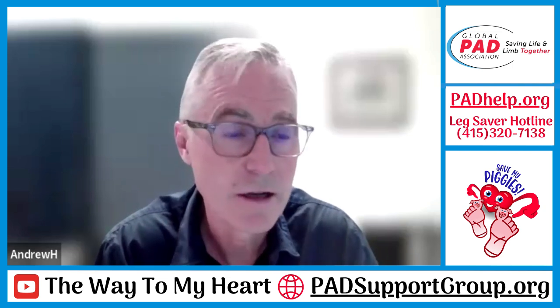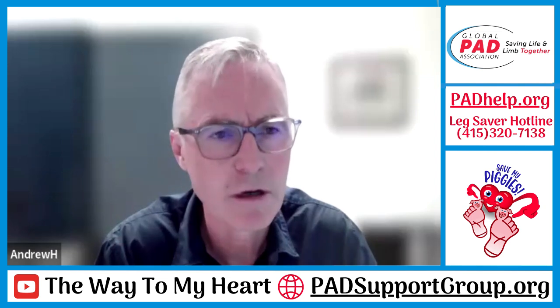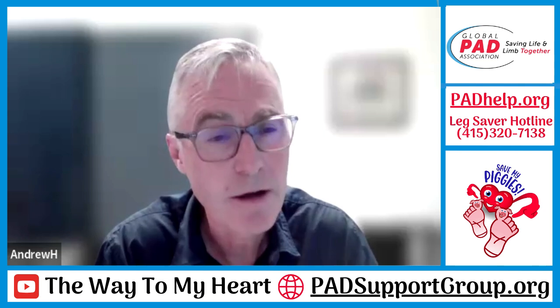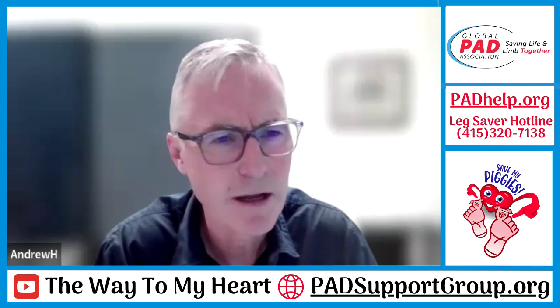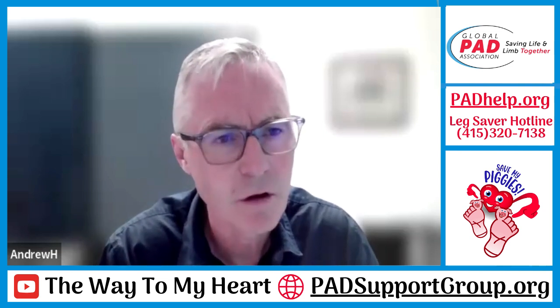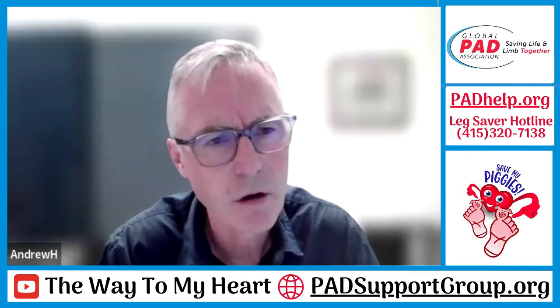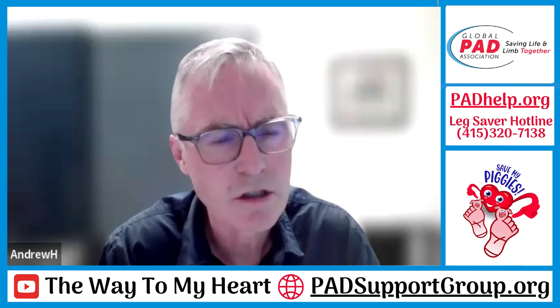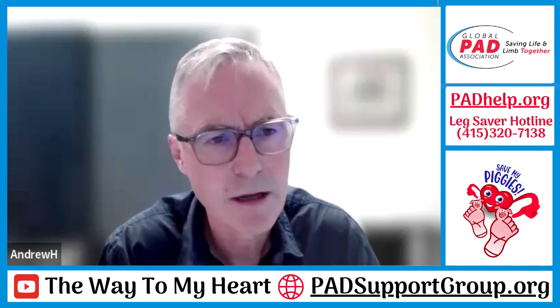And of course, this is a non-traumatic technology, and we saw a really good safety profile with our first human experience. So our experience really was that we were producing a different kind of angioplasty. It did look like there was a permanent stent in the arteries, even though you pulled the stent out at the end. And on follow-up in our cohort in the Deeper OUS trial, the restenosis rates looked significantly lower than what we'd normally expect with plain balloon angioplasty.